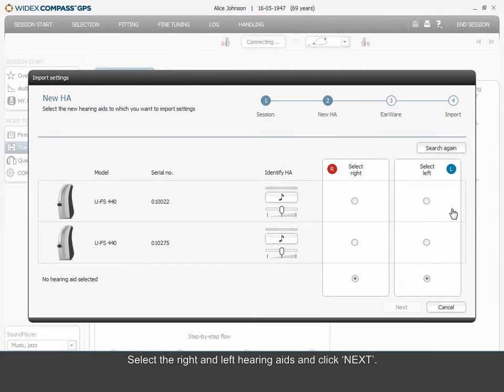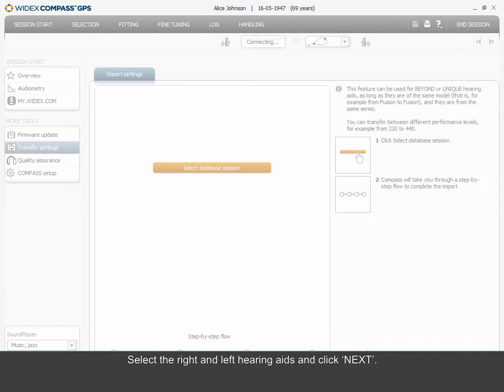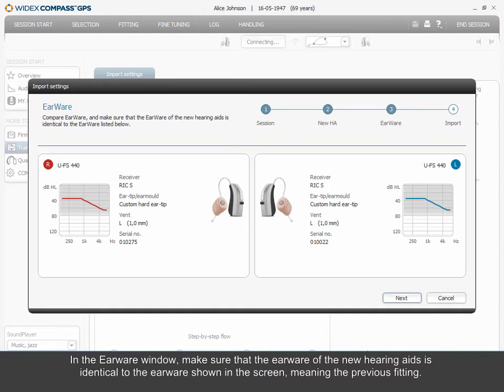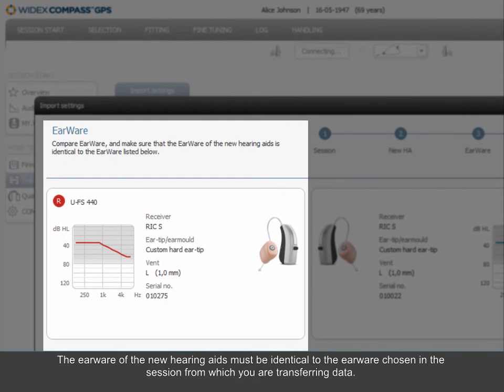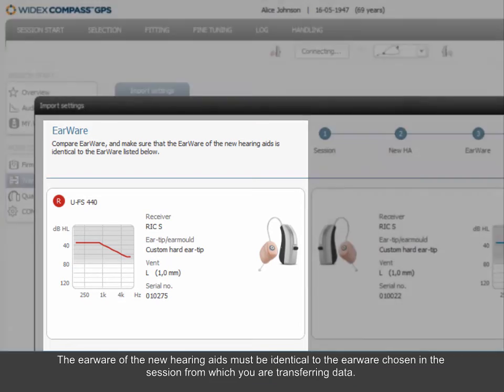Make sure the hearing aids are turned on and ready to be fitted when you select Connect to New HA. Select the right and left hearing aids and click Next. In the Earwear window, make sure that the earwear of the new hearing aids is identical to the earwear shown on the screen, meaning the previous fitting. Please note that you will not be able to select receiver and ear tip as you usually do when connecting hearing aids. The earwear of the new hearing aids must be identical to the earwear chosen in the session from which you are transferring data.